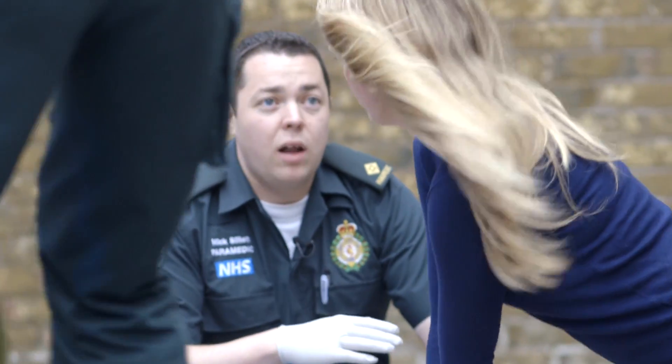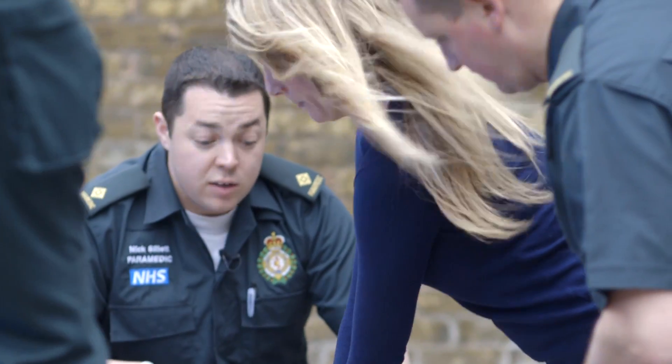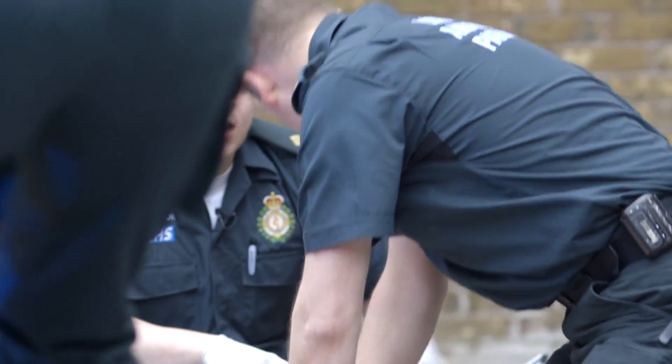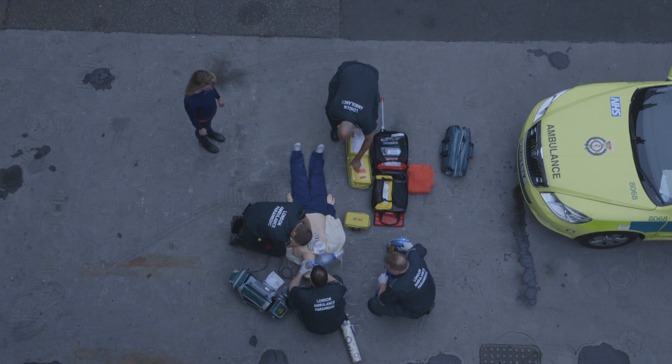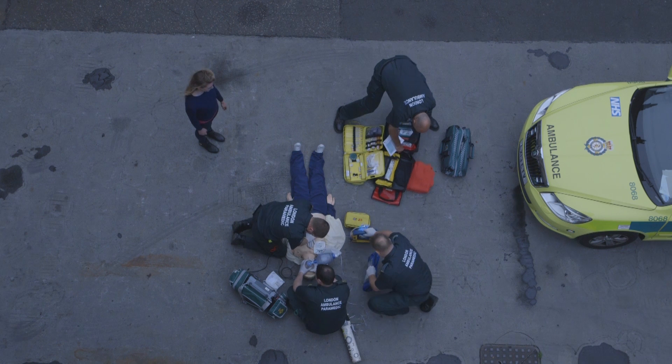Catherine, we're going to do the same thing — we're going to pause to analyse. During that pause, Chris is going to take over the chest compressions. So, pause in two breaths. That's still VF. Chris, are you happy to take over defib? We'll do two-handed to deliver a shock now. VF on the screen, charging to 360. Thank you very much, Paul.